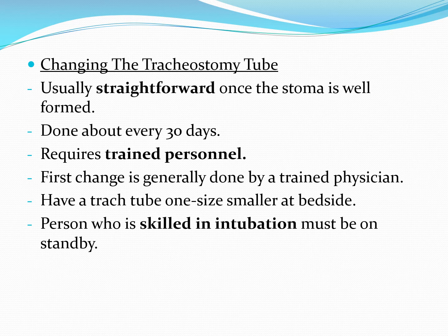Changing the tracheostomy tube is generally a relatively straightforward procedure once the stoma is well formed or well established. In the preceding slide, I said every 2 to 4 weeks, so about every 30 days, or sooner if warranted. Sometimes they will change trach tubes in pediatric patients a bit more frequently, closer to that 2-week interval rather than the 30-day interval.